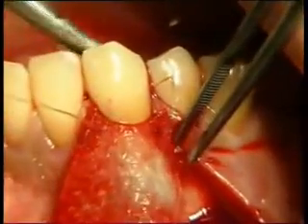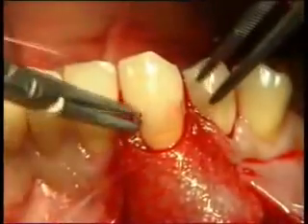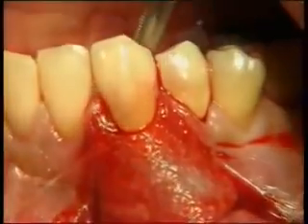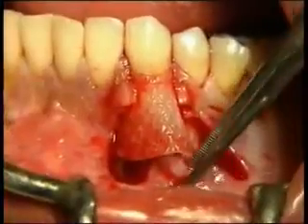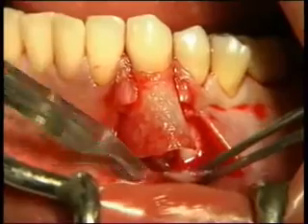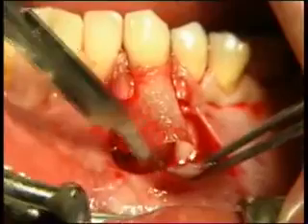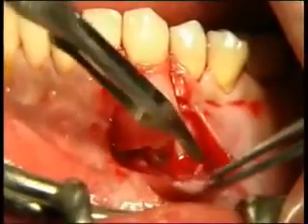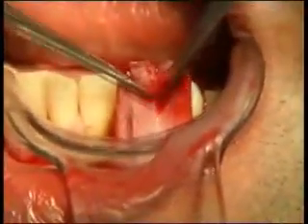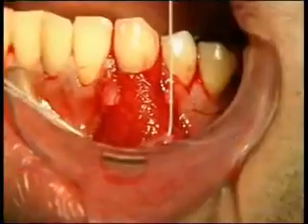The Resolute membrane is purposely raised from the root surface to create the dome effect, due to the two resorbable fragments of PDS-II suture which cross over above the root surface. The periosteum is cut at the base of the trapezoidal flap, initially along the entire length of the flap and then in a more purposeful way to allow significant coronal movement.